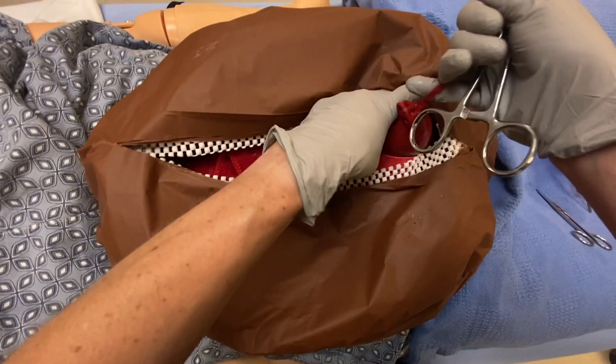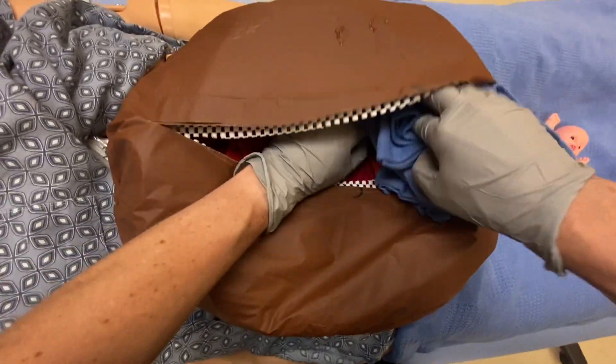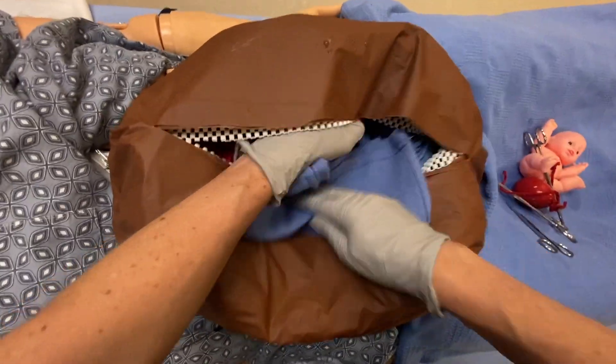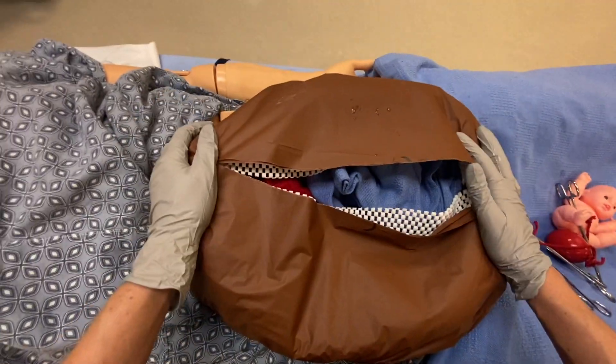We're going to pull the placenta out, and then we're going to pack with sterile towels. And there we have our perimortem C-section.